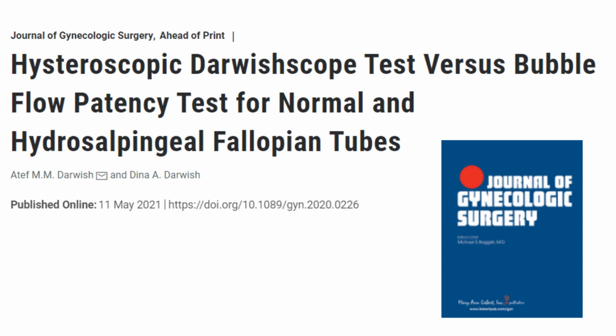This work has been recently published in one of the international journals, and you can find it via PubMed or other sites to see the details of the hysteroscopic Darwishscope test in cases of normal fallopian tubes as well as hydrosalpingeal fallopian tubes.